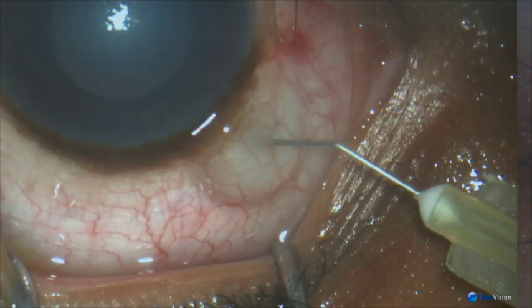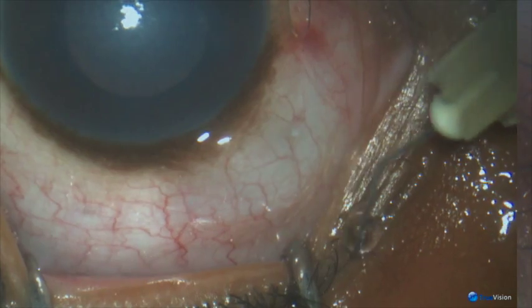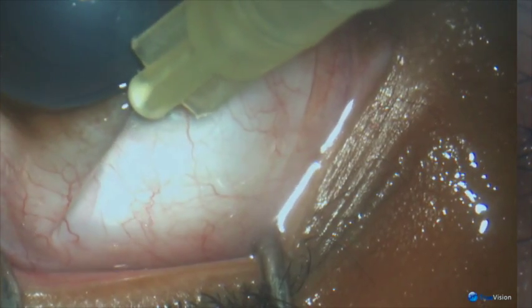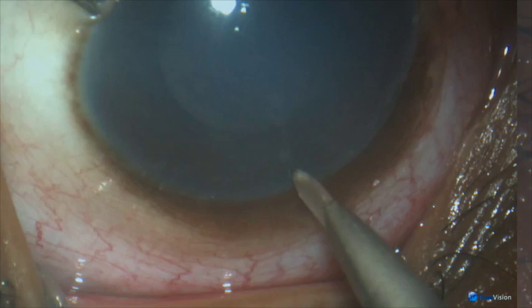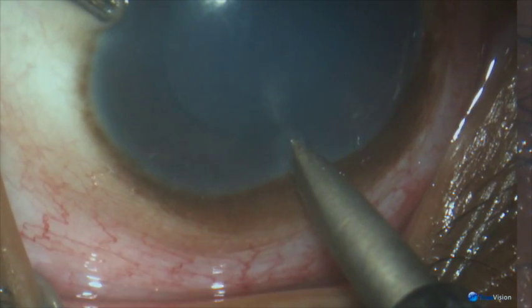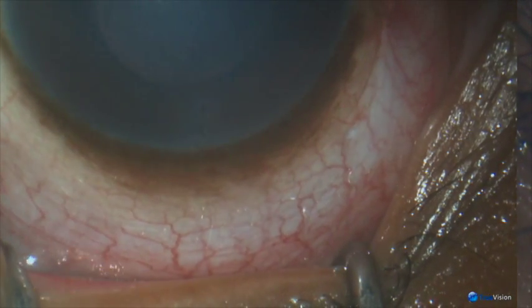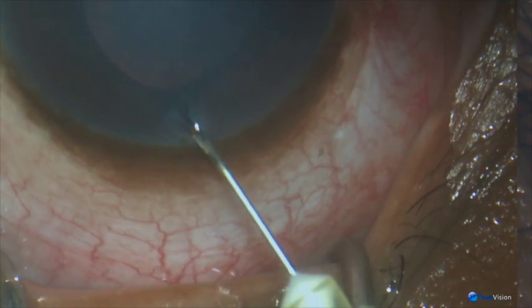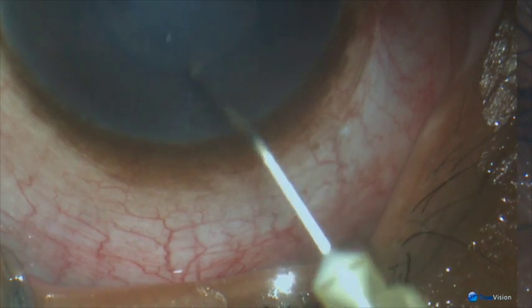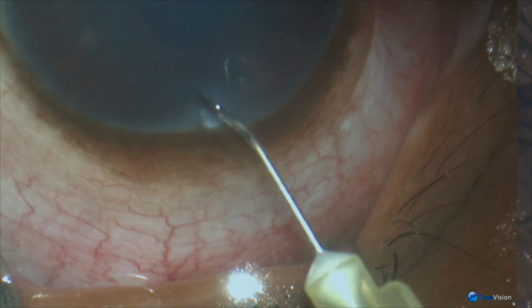Giving subconjunctival mitomycin 0.03%, spreading it around the limbus, then making a vertical radial incision into the anterior chamber. Contracting the pupil with pilocarpine 0.5%.